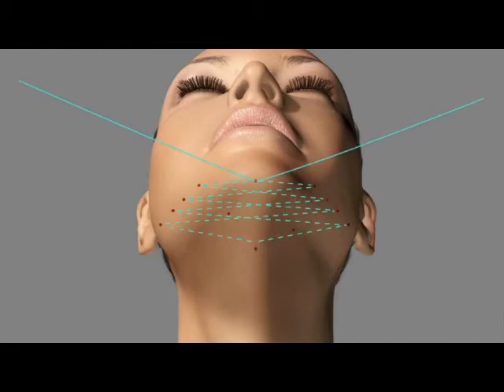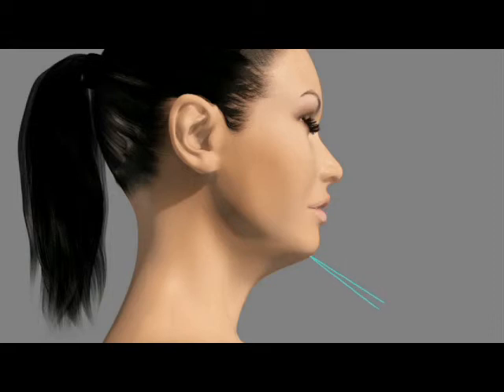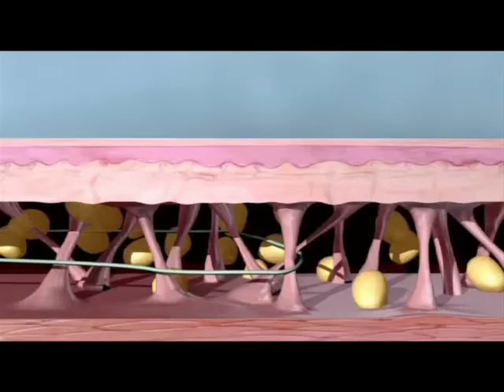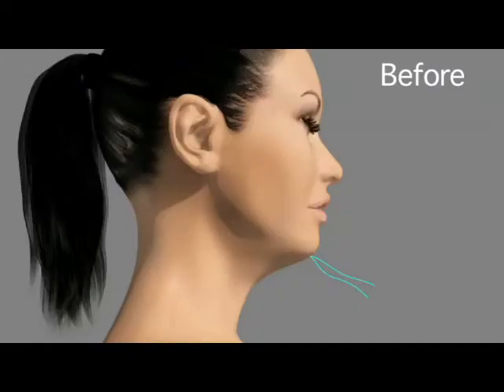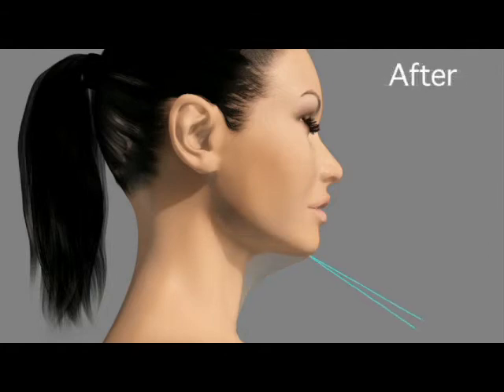Upon completion, the two ends of the suture are tightened and the suture rods are cut free. The assistant puts gentle upward pressure in the submandibular area, thus helping to place tension on the suture matrix. The appropriate amount of tension of the trampoline is obtained when there is visual dimpling of the two anterior anchor points along the lateral ramus, as well as visible tension lines underneath the jawline. This dimpling and the tension lines resolve in most patients within 24 to 48 hours.